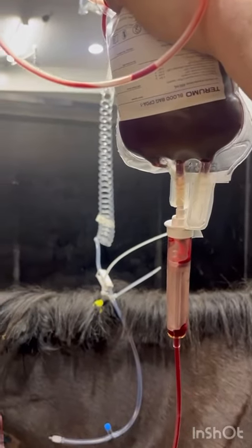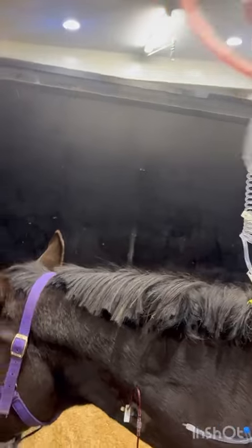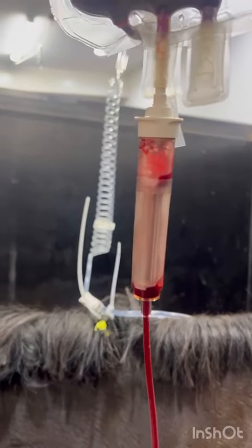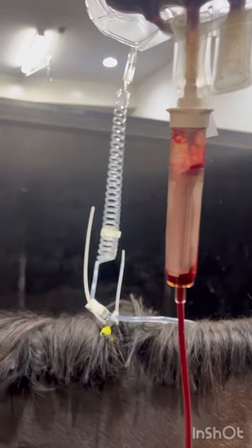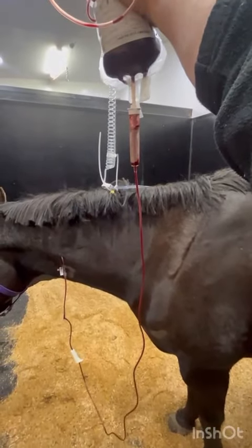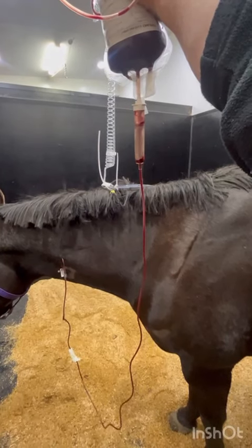Then we attach a blood giving set and hook that up to the patient. The blood giving set has a filter to catch any clots that may have formed during the collection process, and then we can transfuse this life-saving blood to our patient so we can stabilize her for surgery.